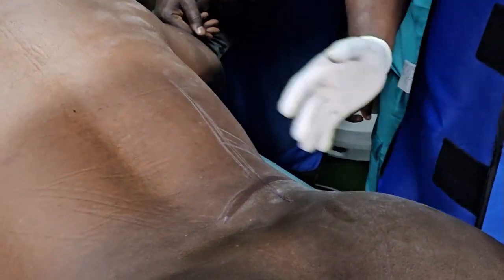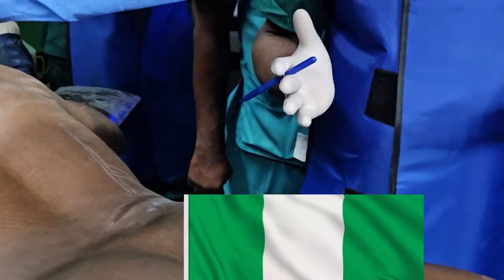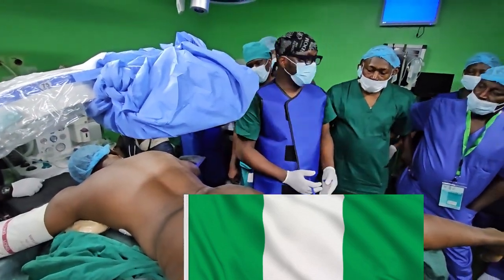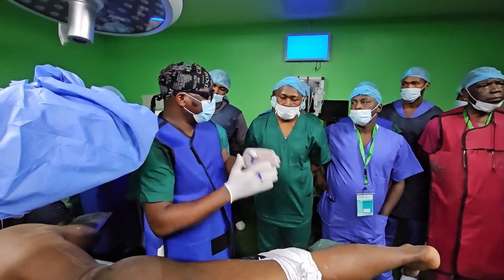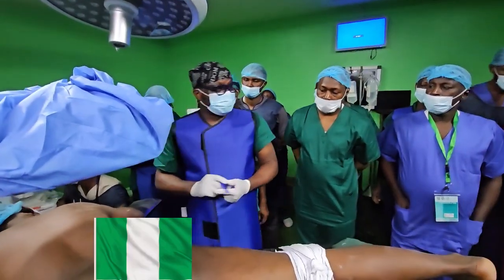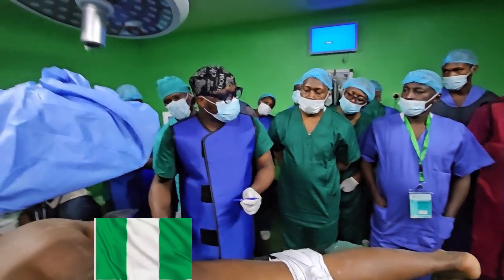There are all sorts of opinions about it. People say you should draw the posterior axillary line with the patient sitting or standing in neutral position even before you do your procedure. That's when you'll be able to get where it was. Once you position the patient prone, it changes. But let me tell you, even if I don't do marking, I can do a safe procedure.